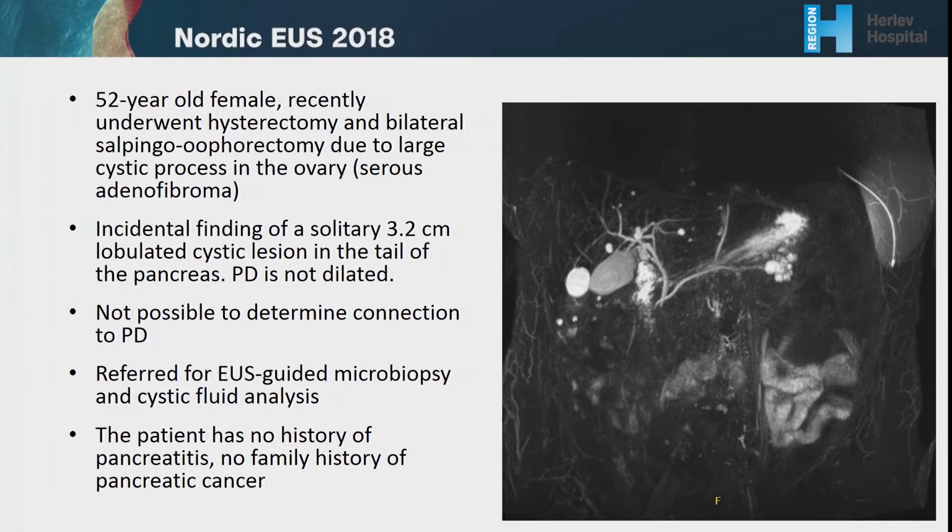It was not possible to determine a connection to the PD on the MRI, and the patient is now referred for an EUS-guided microbiopsy and cystic fluid analysis. The patient has no history of pancreatitis, and no family history of pancreatic cancer.